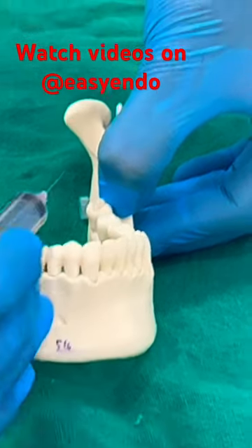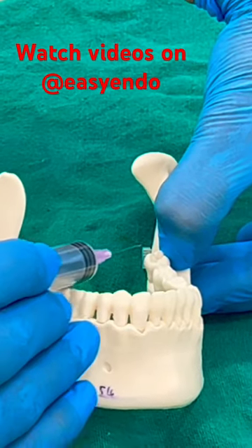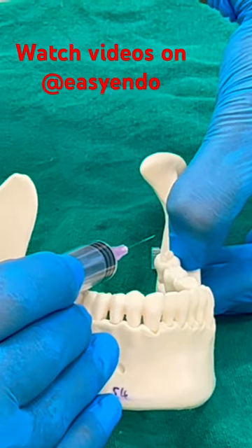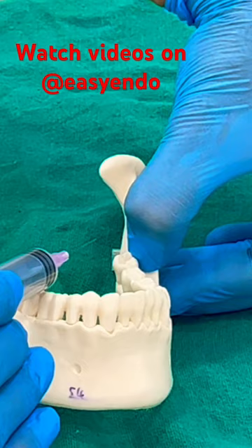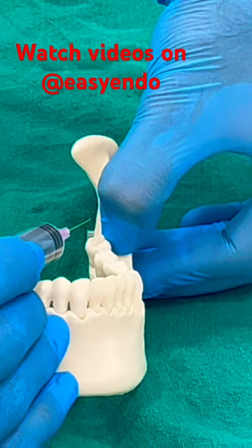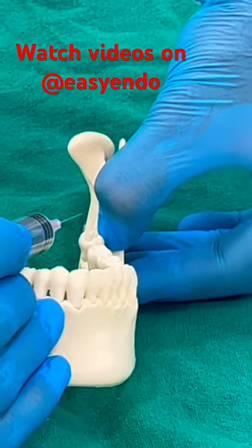Another situation that can arise is early contact. If you feel the bone too early while inserting the needle, what you need to do is withdraw the needle a little bit, go a little medial, and then insert the needle again till the full length. That is how we target this area.